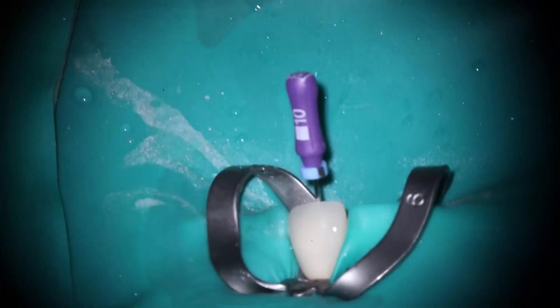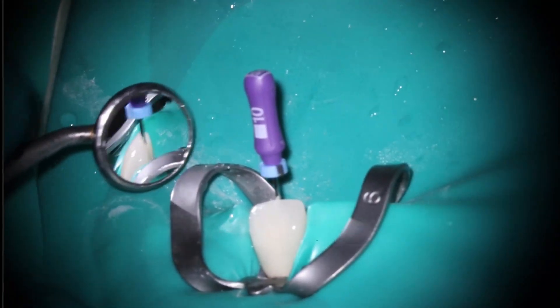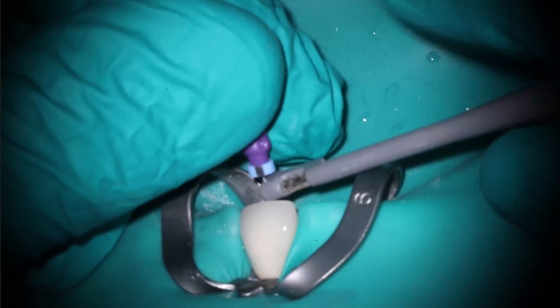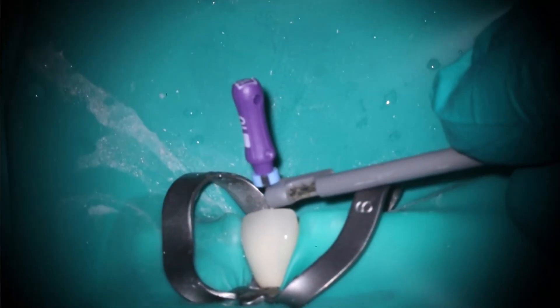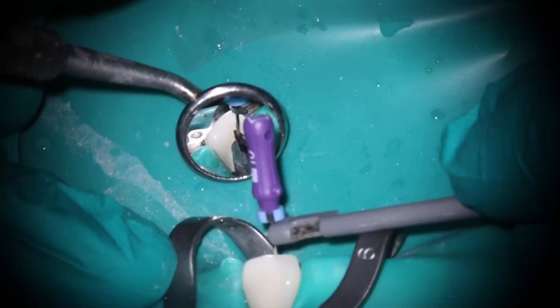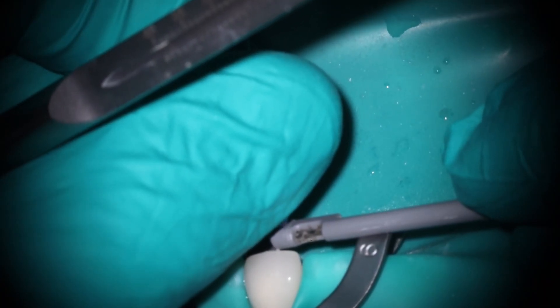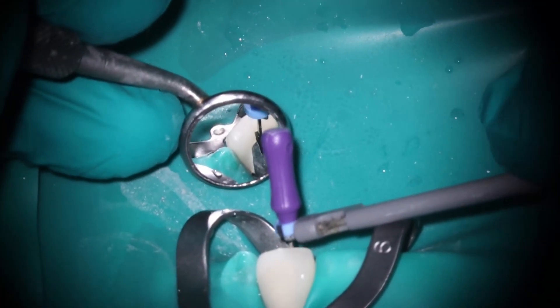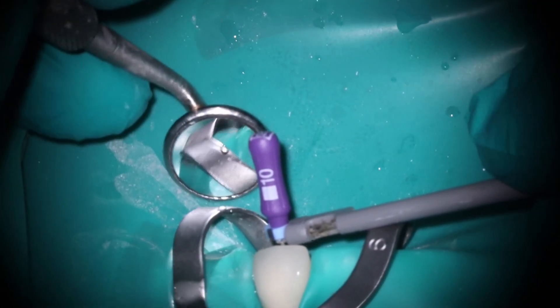I'm going to go ahead and get the working length here, and I think this really exemplifies how important that access is. Look at the angulation — this file is completely straight and it still wants to be pushed out to the buccal, hitting on the surface of the porcelain. You'll notice when you take working lengths on those traditional cingulum accesses, the file almost comes out bent because it gets pushed so far palatally. The long axis of the tooth ideally is going to go out the incisal edge.